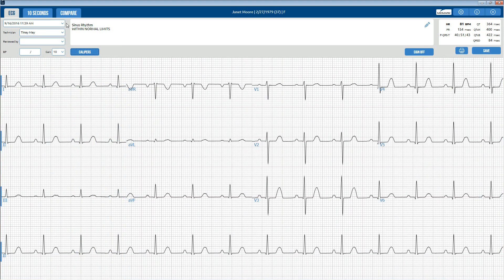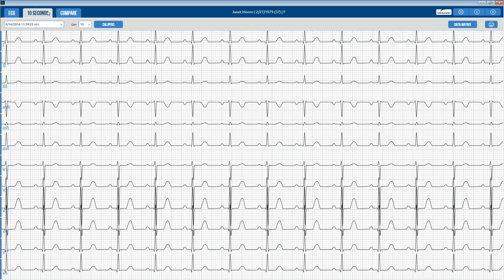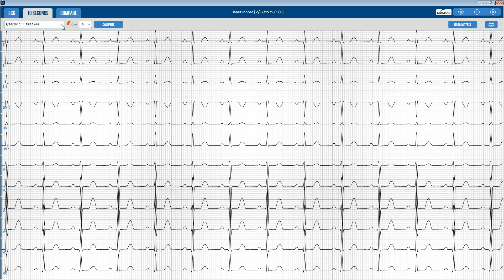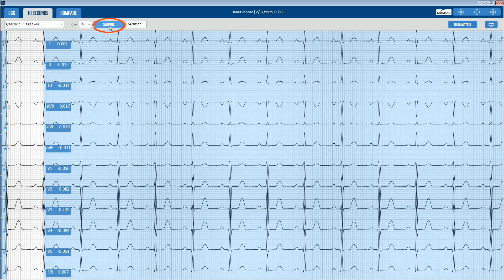The 10-second tab will display all 10 seconds from each of the 12 leads on one screen — the full disclosure of a 12-lead resting ECG test. The menu bar displays the date and time of the selected report with a drop-down to select a different report and a drop-down for gain. The calipers work the same as in the ECG report review screen.